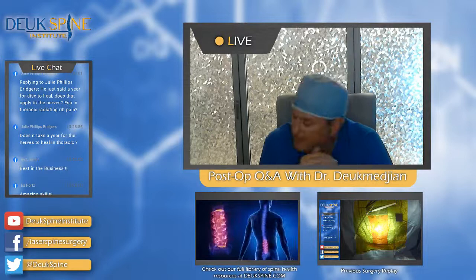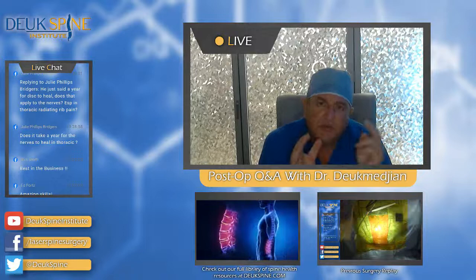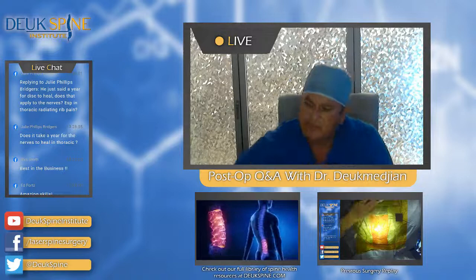Any other questions? Yes, does going through the front cause any harm to the disc with that approach to access the back? So the question is, does going through the front of the disc like you did cause any damage to the disc? And the answer is no.